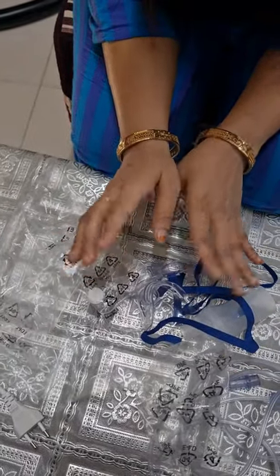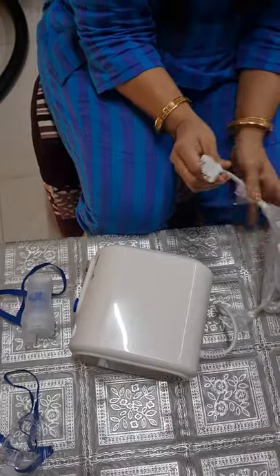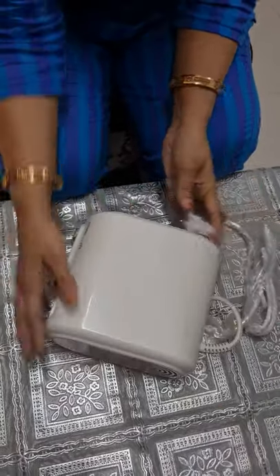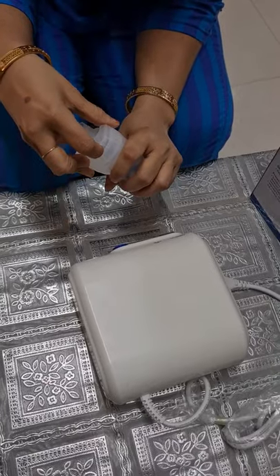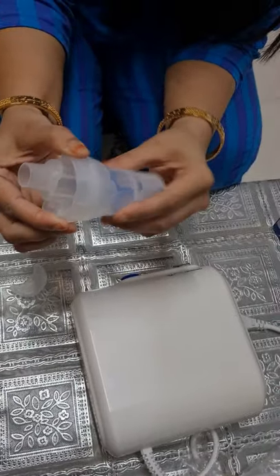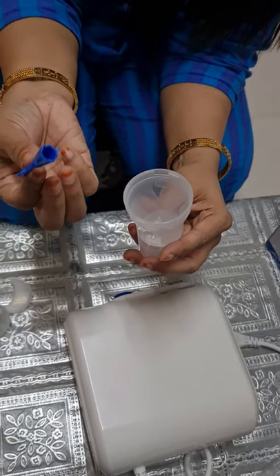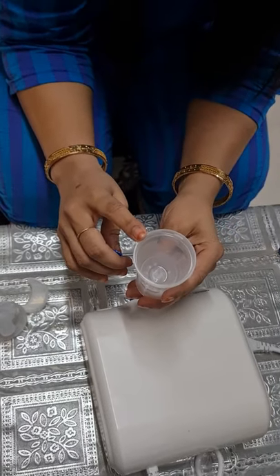Now I will tell you how to use this nebulizer. First of all you need to connect this with your power outlet, and make sure that the switch is in off mode. First we install the medicine device. You can open it — there is a cap over here, open this cap first, then open it from here to insert the medicine. Remove the vaporizer head from the medication tank, then add the correct amount of medicine — it varies from 2 ml to 7 ml depending upon doctor's advice.